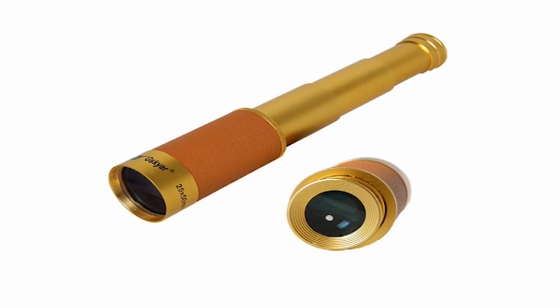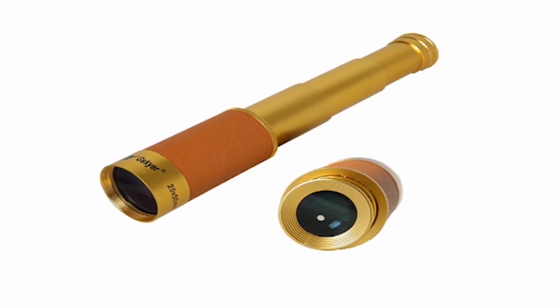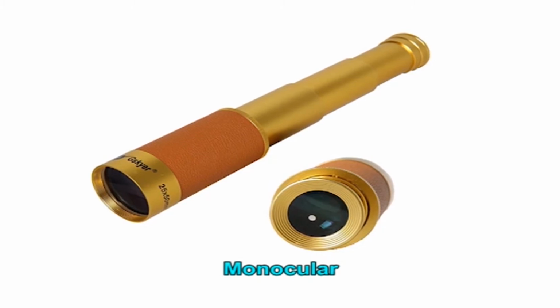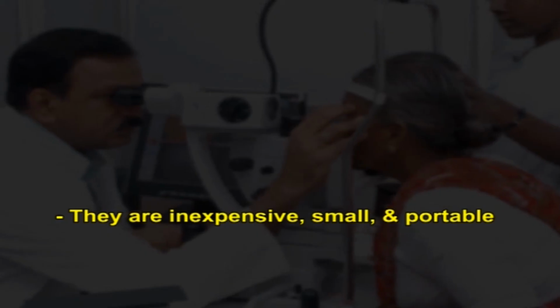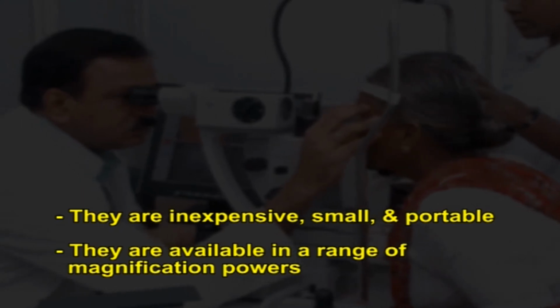The most common type of distance optical device is the handheld telescope, also called a monocular because it is used with one eye and has a single eyepiece. The advantages of handheld telescopes are, they are inexpensive, small and portable. They are available in a range of magnification powers.